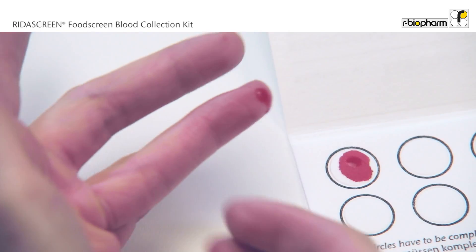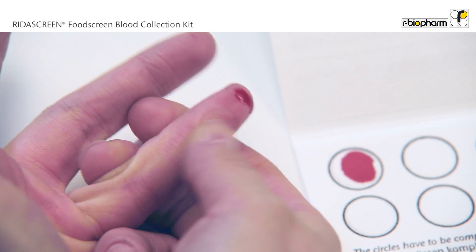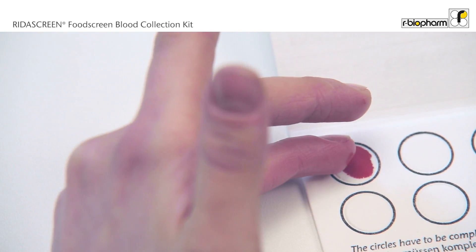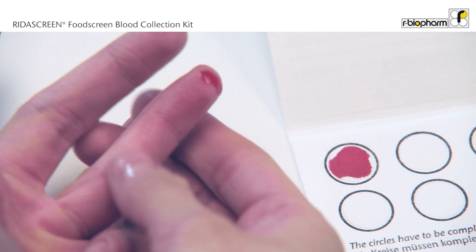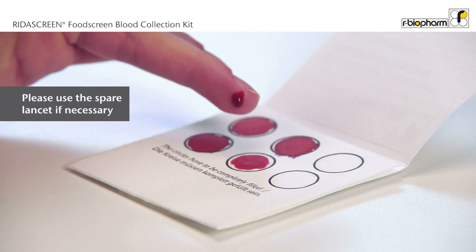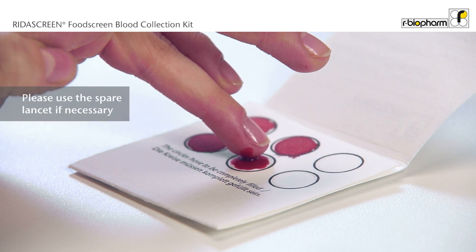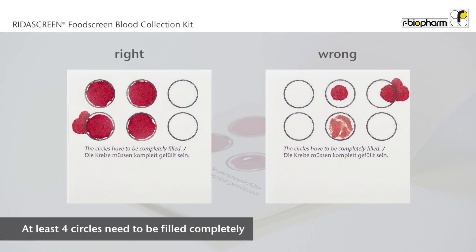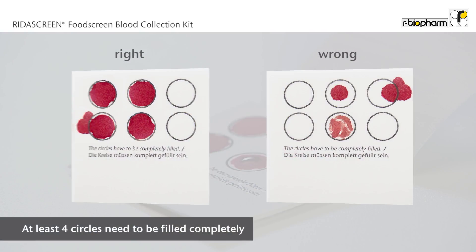Several drops of blood may be necessary until the blood has soaked to the border of the circle. You may want to relax and massage your finger in between. To guarantee sufficient blood flow, use the spare lancet if necessary. Repeat this procedure for the other circles.